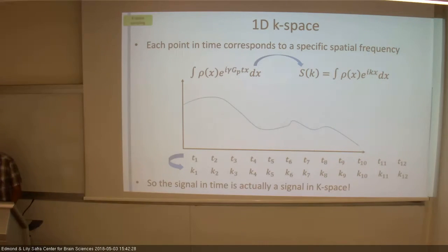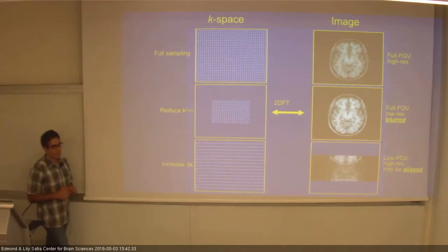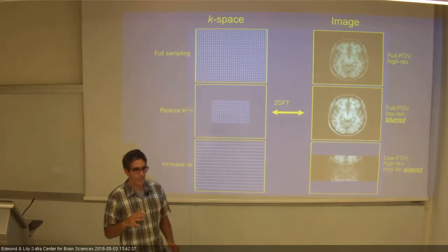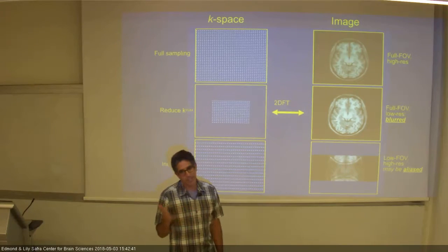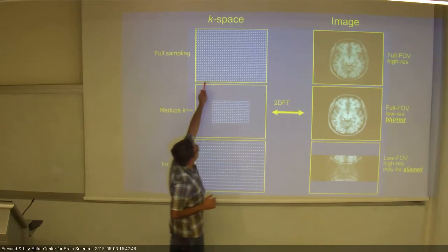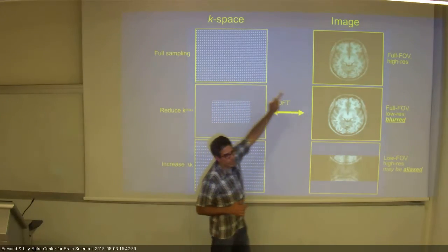It's amazing that it's actually working. But it is. So what people then do, then there is a question of time. I'm just going to tell you something about the reality of scanning now. Measuring all the positions in K space still takes time. And if we take the full image, it takes very long. We need all the positions. We have the amplitude of each position in K space, so we can generate the image.